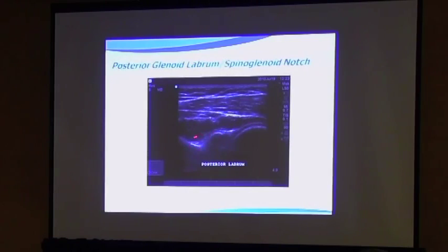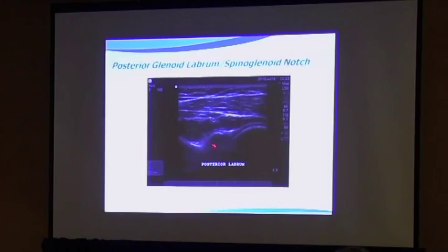You always want to assess this for glenoid cyst with the patient in internal rotation, just bring their arm across their front side. In external rotation, there's a vein that becomes very prominent, and if that's the only position you look at the patient in, you might mistake that for ganglion cyst. So if you see that in external rotation, bring their arm across in internal rotation and it'll just flatten right out. If it's a real finding, if it's a ganglion cyst, it won't.